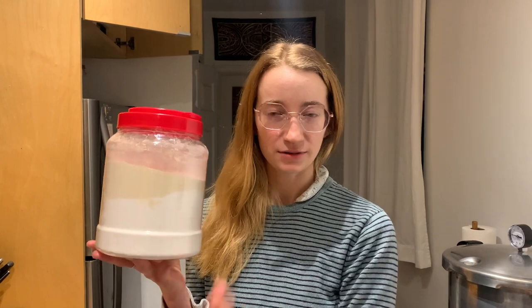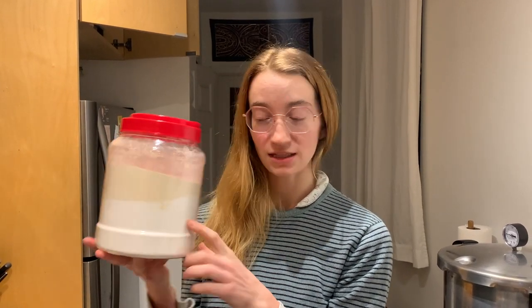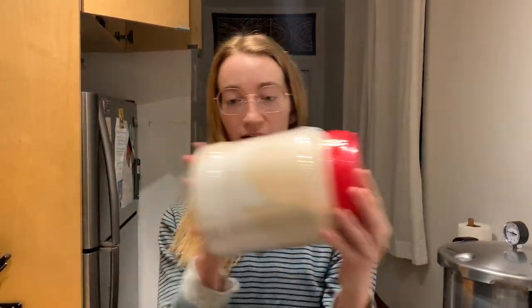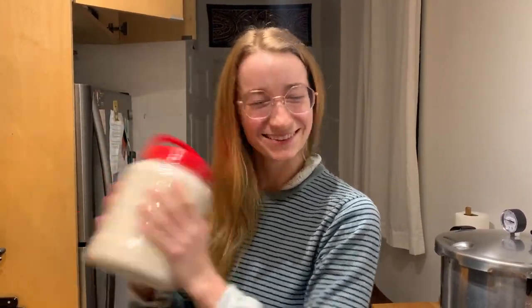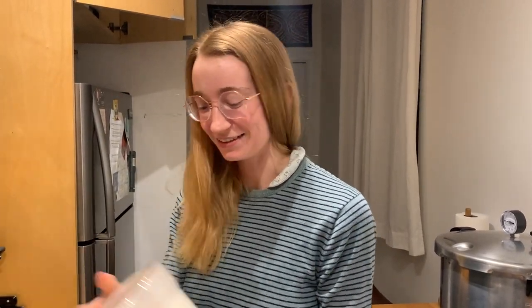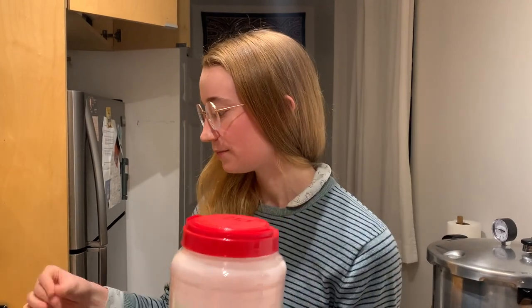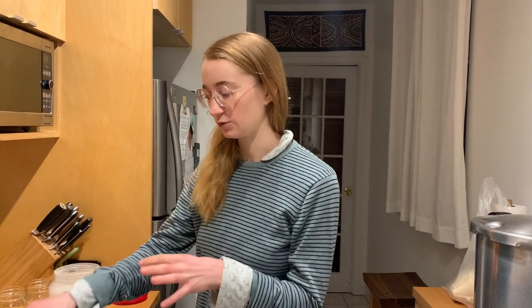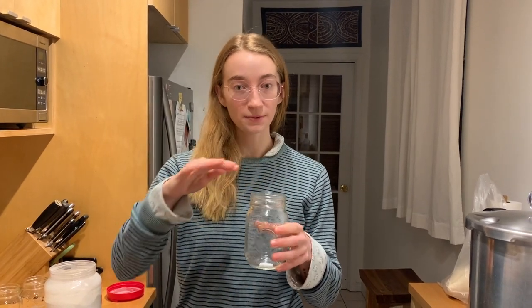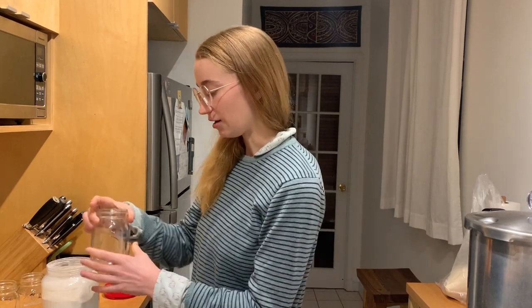We have a larger container here — this used to store noodles, but you can use whatever you have. We have two pounds of dextrose and a half pound of barley malt extract. Just shake it to make sure it's really homogenous. This is what you'll measure 20 grams from per jar. Since we're using only 300 milliliters of water rather than 500 — so the mycelium has enough oxygen — we'll use the same ratio scaled down to 12 grams per 300 milliliters.